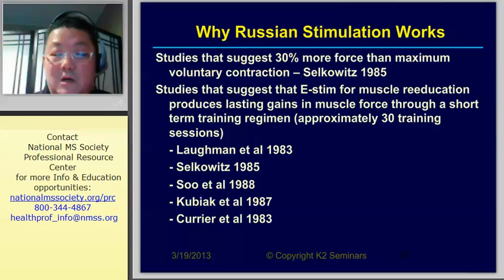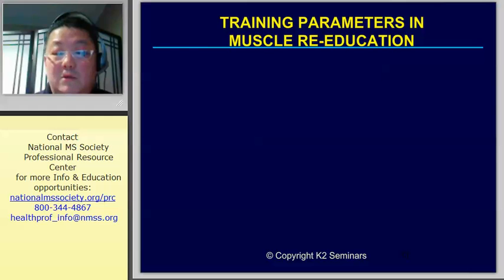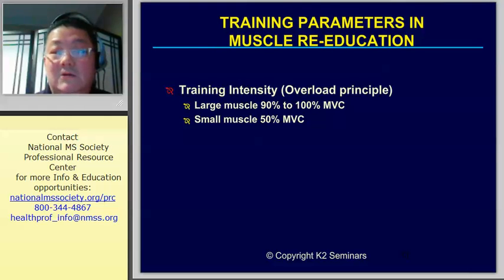I know you're saying approximately 30 training sessions, right? But those 30 sessions might be only one with you and the rest with the patient at home with their portable unit. So realize that it's not necessarily something that you have to do in the clinic. Here are all the studies. Incidentally, if you want the references, I'll be more than happy to send them to you. Otherwise, they're all located throughout the presentation.